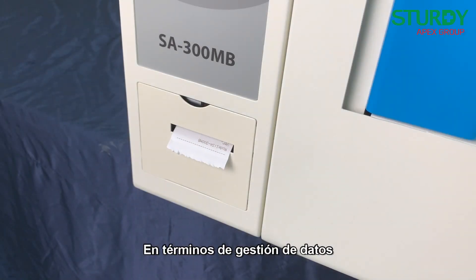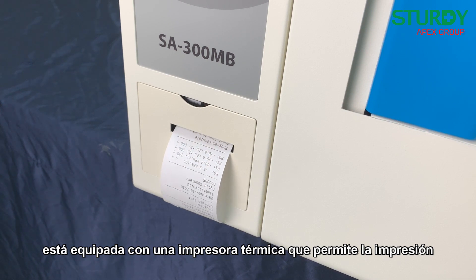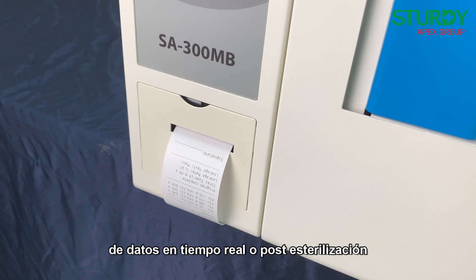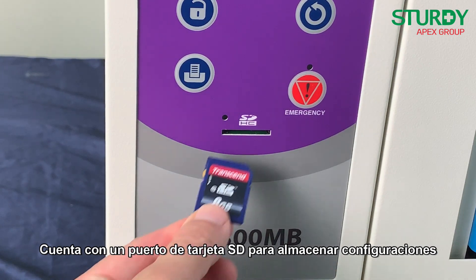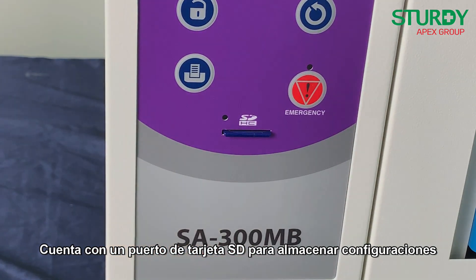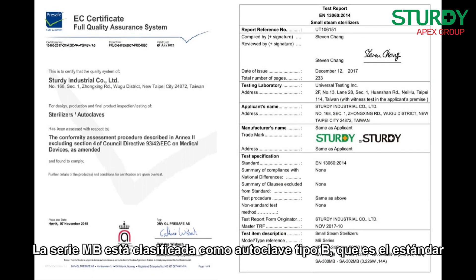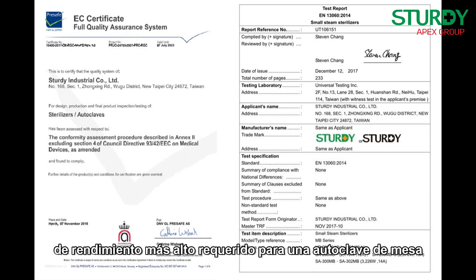Post-sterilization vacuum guarantees less than 0.2 percent moisture for solid load non-wrapped products. In terms of data management, it is equipped with a thermal printer to enable real-time or post-sterilization data printing, as well as an SD card port to store sterilization settings and results for data management. The MB series is classified as a Type B autoclave, which is the highest performance standard required for tabletop autoclaves.